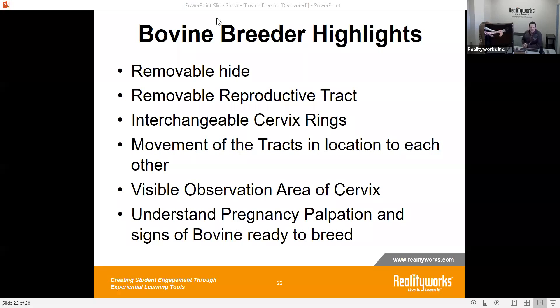We also have movement of the tracts in relation to each other. With the bungee cords, you can lower the cervix, lower the reproductive tract, raise it up, or move it side to side as needed. The same applies to the digestive tract — moving it around allows a larger or tighter range of motion depending on what you want your students to be able to do.